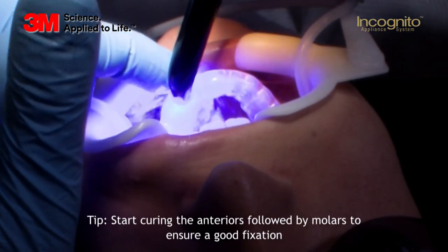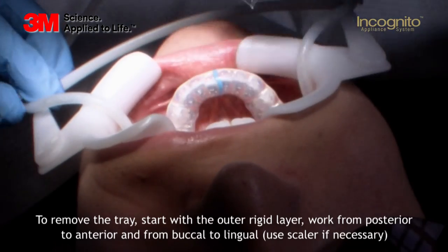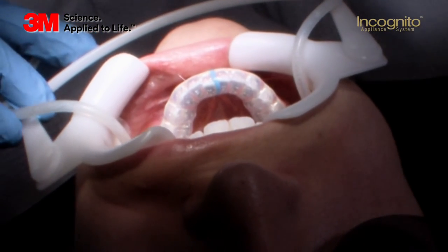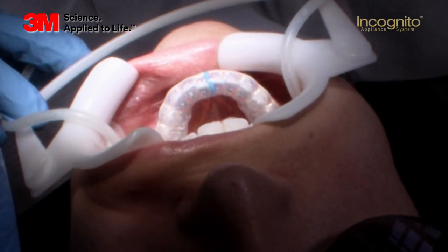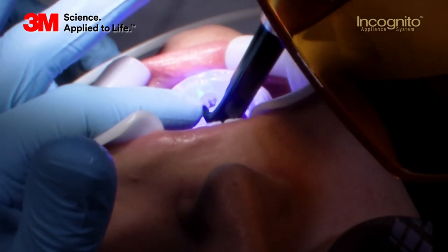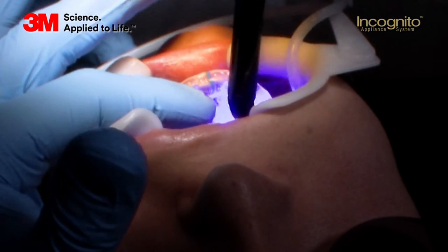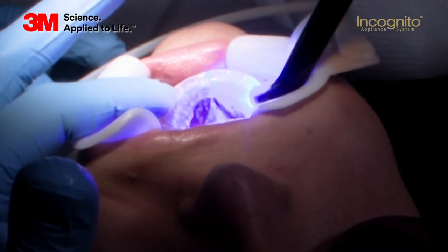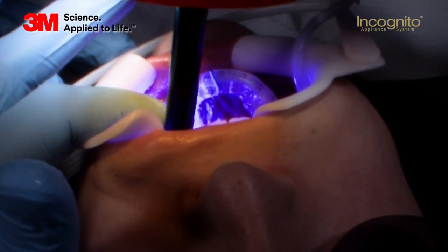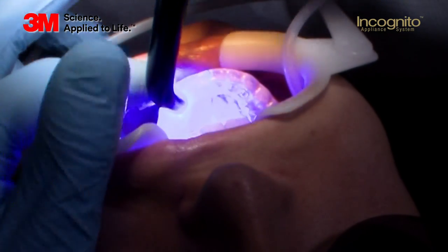After you've started curing the bonding, you will be able to remove the hard tray of the clear position tray — this is the outer hard shell. After having done this, I cure again and make sure that I also cover other surfaces from the lingual side. If you have any metal crowns where you have to bond on, please make sure that you stick to the working time of two and a half minutes, because the light won't be able to access the bonding material and cure it via light. Always double-check what kind of tooth surfaces you will bond on.